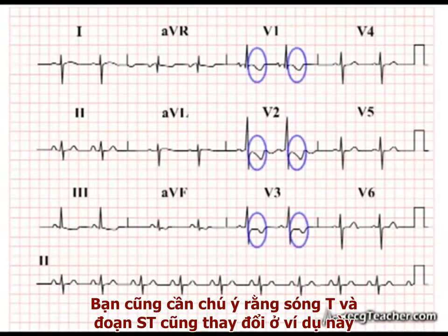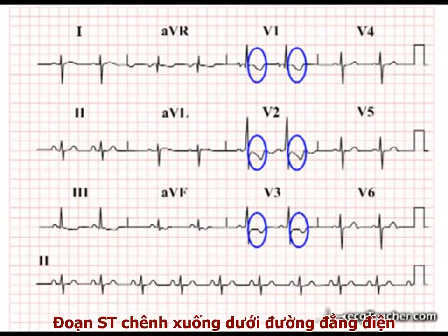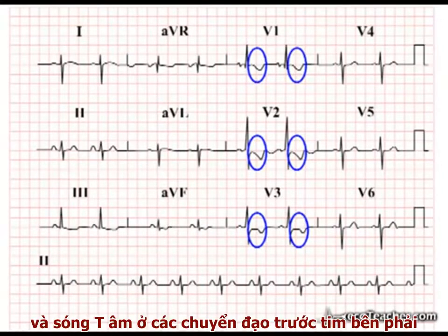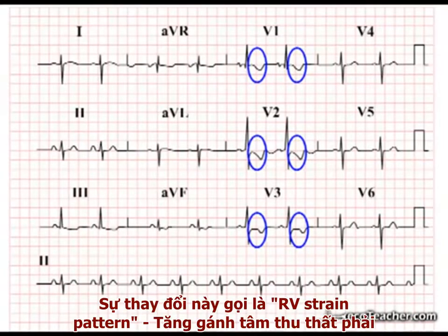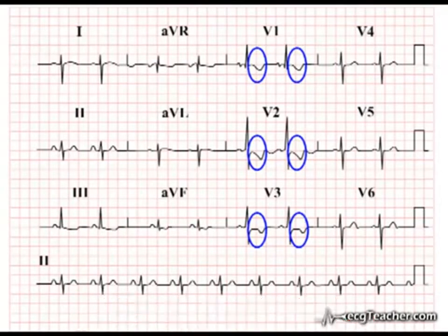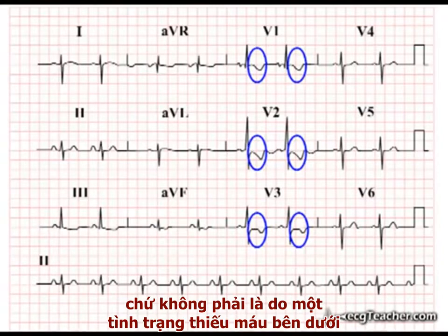You will also notice the T wave and ST segment changes present in this example. The ST segments are depressed below the isoelectric line, and the T waves are deeply inverted in the right precordial leads. These changes represent a right ventricular strain pattern secondary to hypertrophy and do not reflect any underlying acute ischemia.